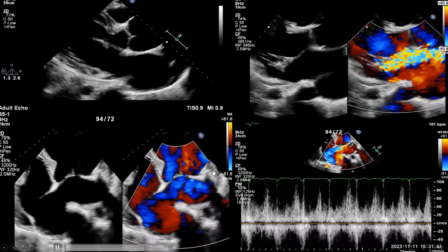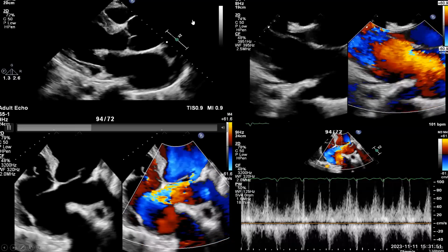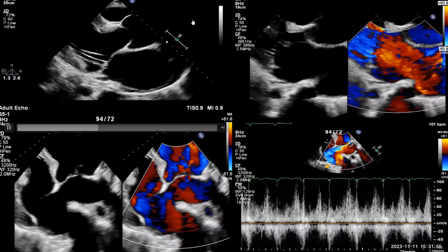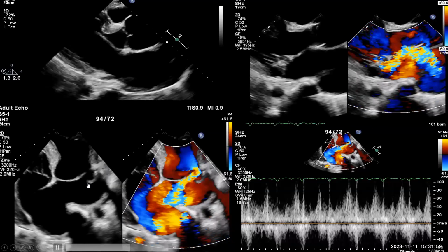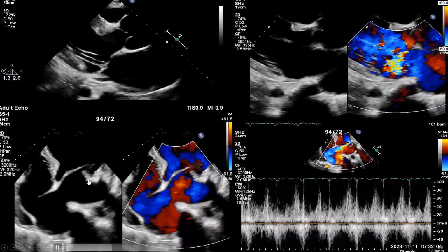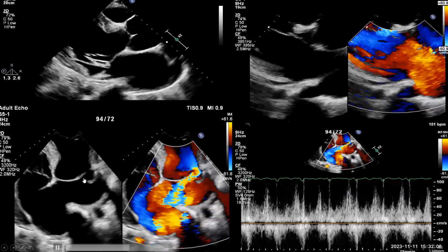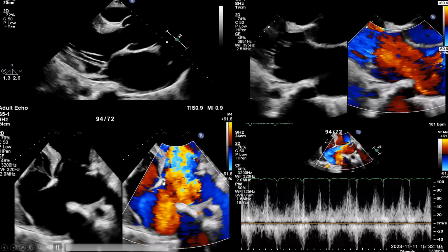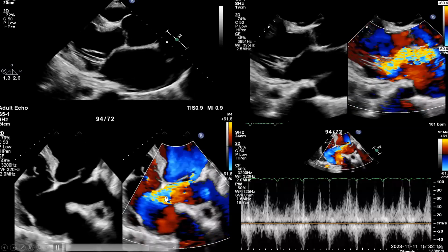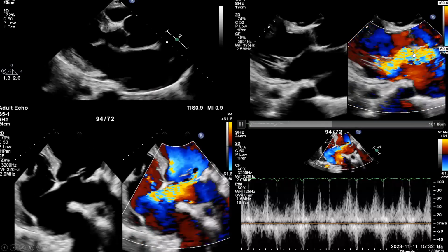So as I said, okay, what we said here, primum ASD. Somebody said Marfan. This is an excellent answer. Why did you say Marfan? Because we have myxomatous mitral valve. You can see here in apical four chamber, you have prolapsing and flail posterior mitral leaflet, that's why you have severe MR, a very huge MR jet, anteriorly directed, as you see here. What else?